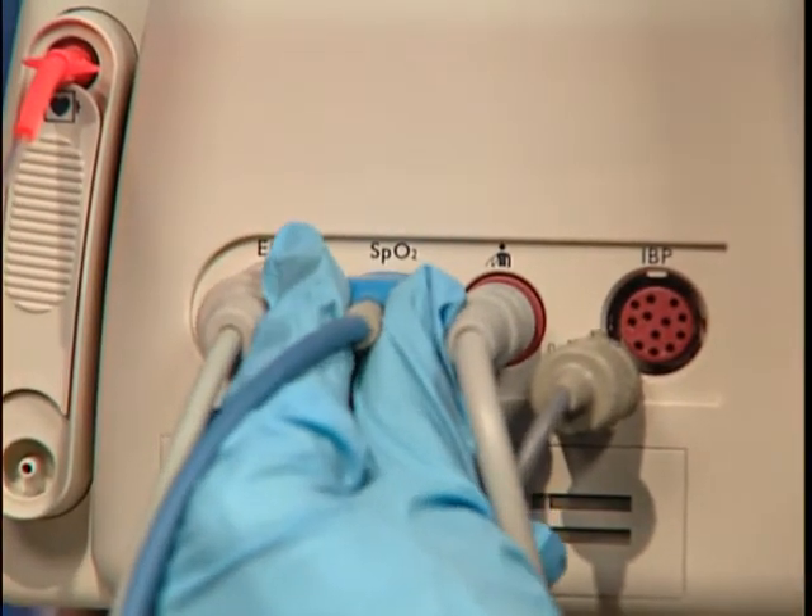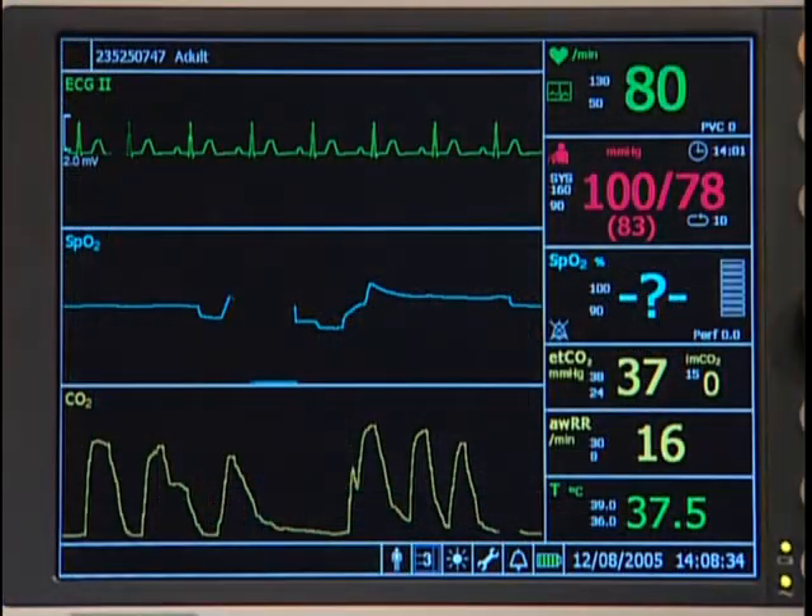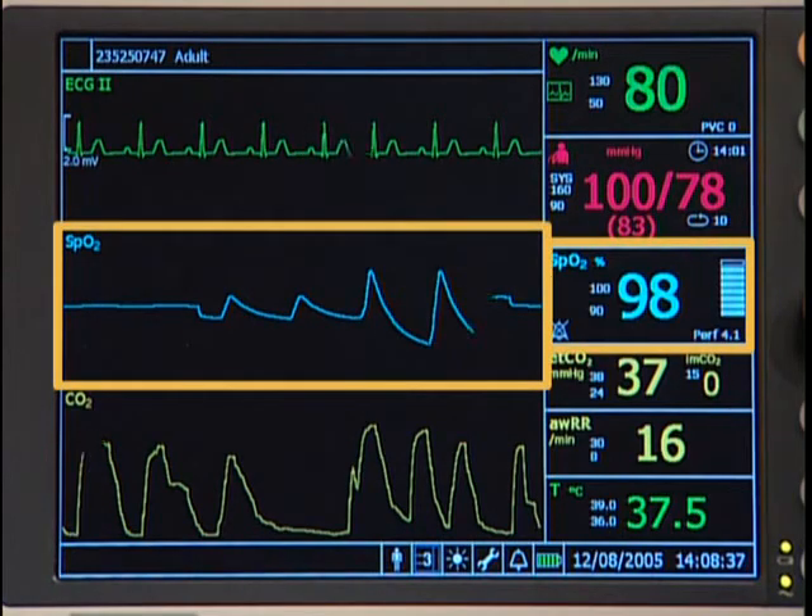Connect the SpO2 cable to the monitor. In a few moments, the wave and oxygen saturation numeric appear.